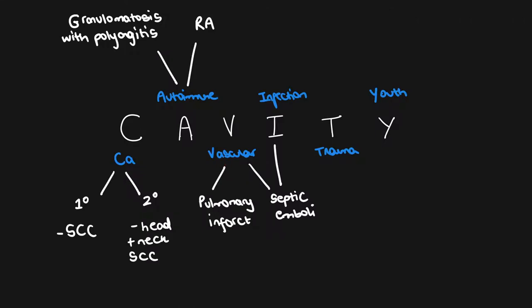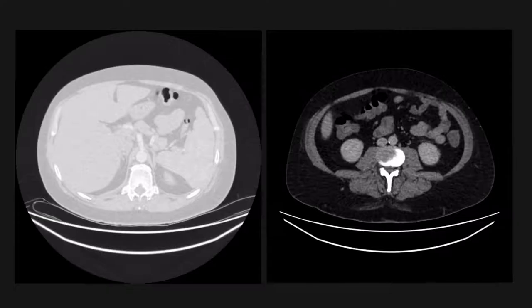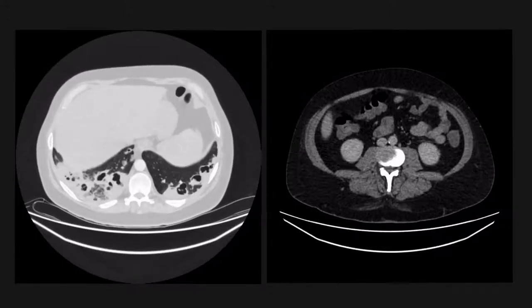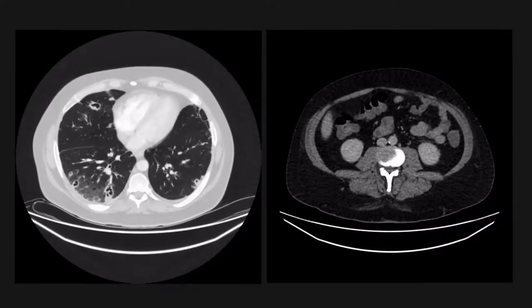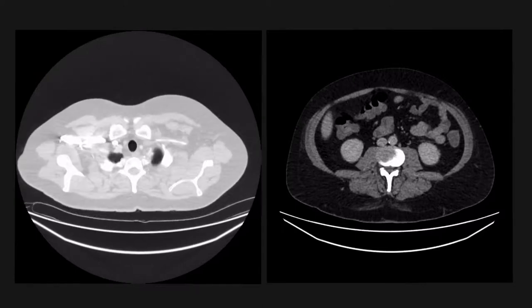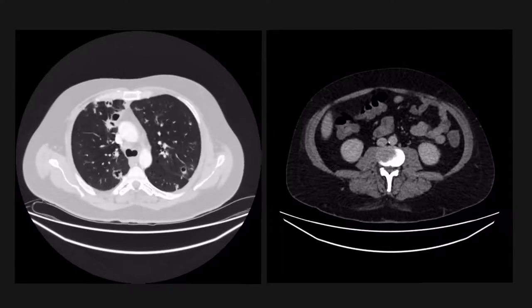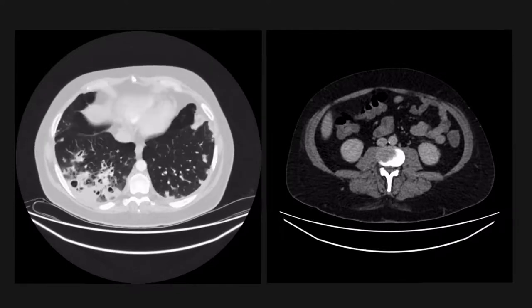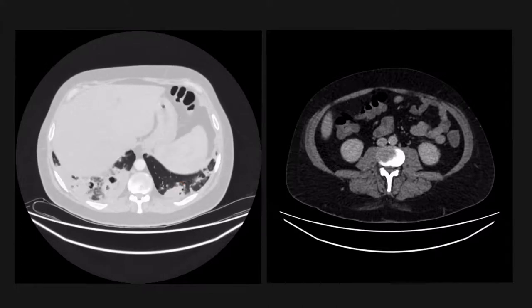Now we're on to V for vascular. These are pulmonary infarcts which can cavitate, and also something that relates to both vascular and infectious causes: septic emboli. These images are from a patient who presented very sick and septic and had a history of being an IVDU. On the CT chest, the lungs are grossly abnormal with multiple pulmonary nodules, most of which are cavitating, and they are worse in the lower lobes bilaterally. This is a case of septic emboli.